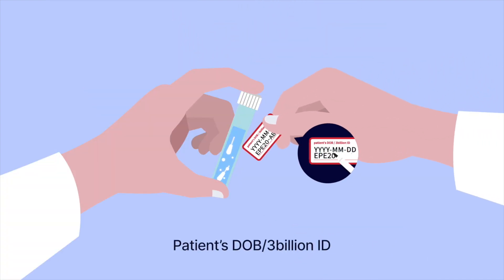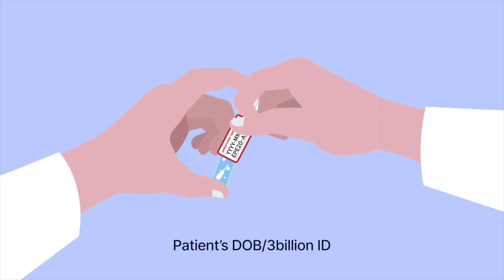Last, label the sample with the patient's date of birth and 3 Billion ID. Your sample has been collected.